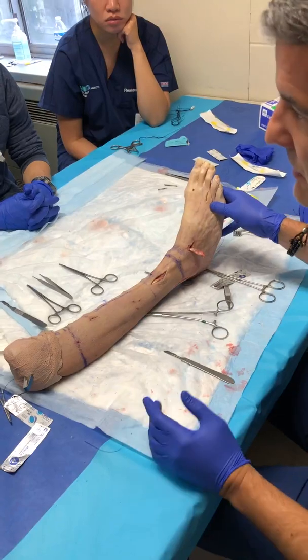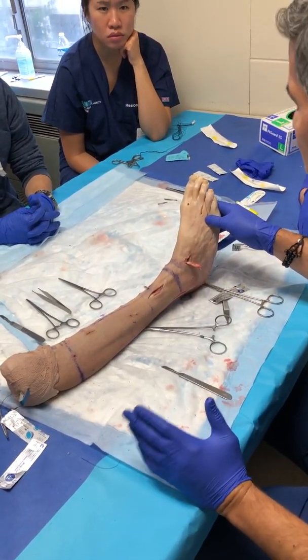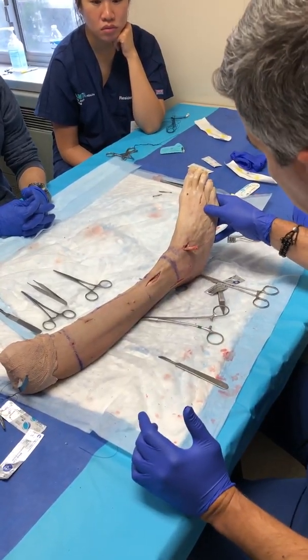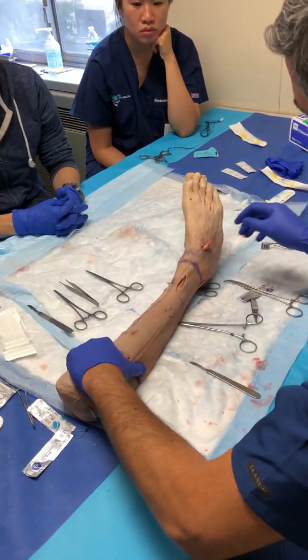If it's an arthritic joint, does it really matter? No. You just want to be sure that you grab as much bone as possible. Okay? If you grab one of the adjacent joints, it's not a problem. That makes sense? Okay. For the tibialis anterior tendon transfer.